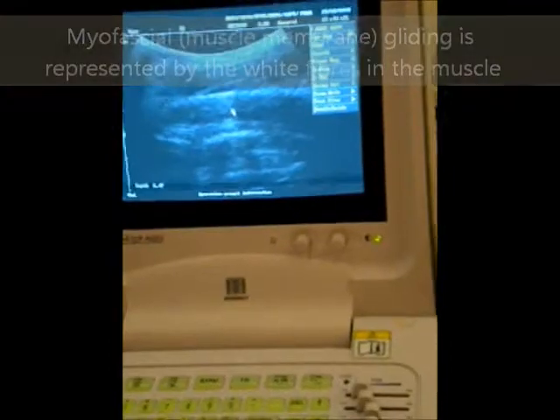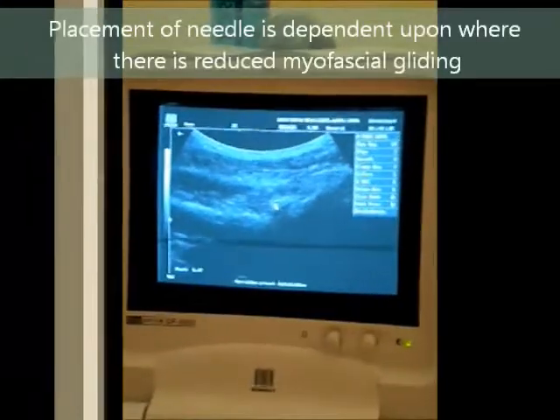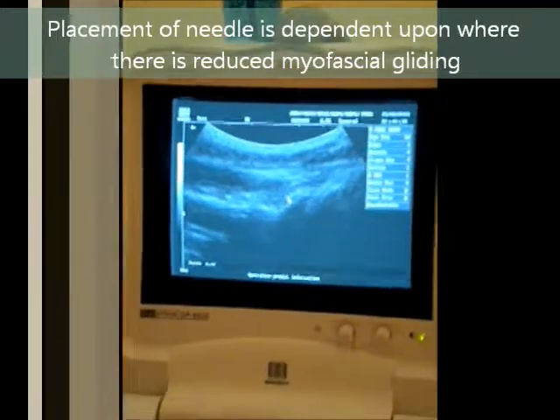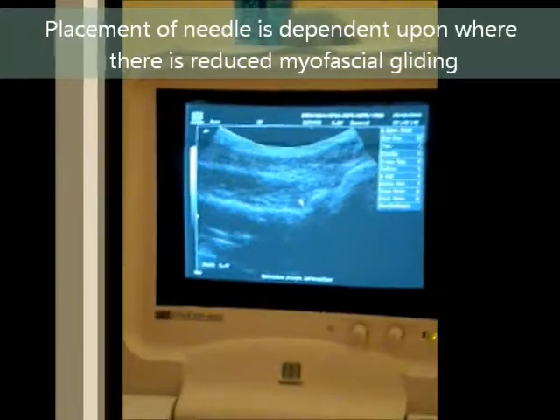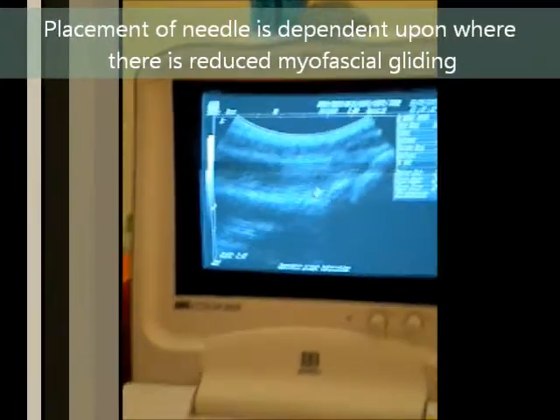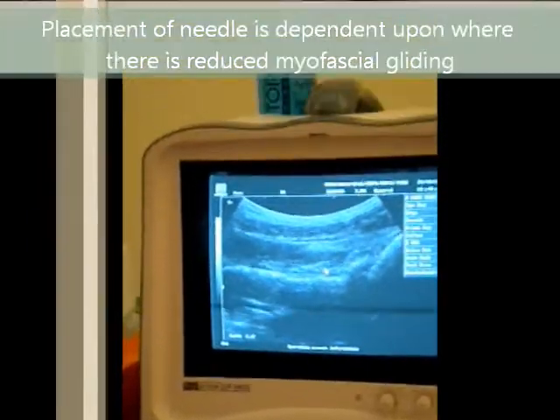And as I take the probe to the outer edge, we should be able to see the head of the humerus again. Now we use this so that we can find a place where we can put a needle — an acupuncture needle — to try to improve the myofascial gliding.